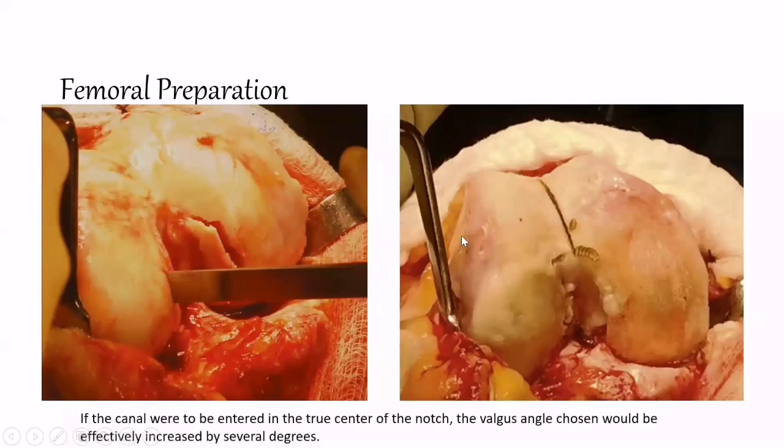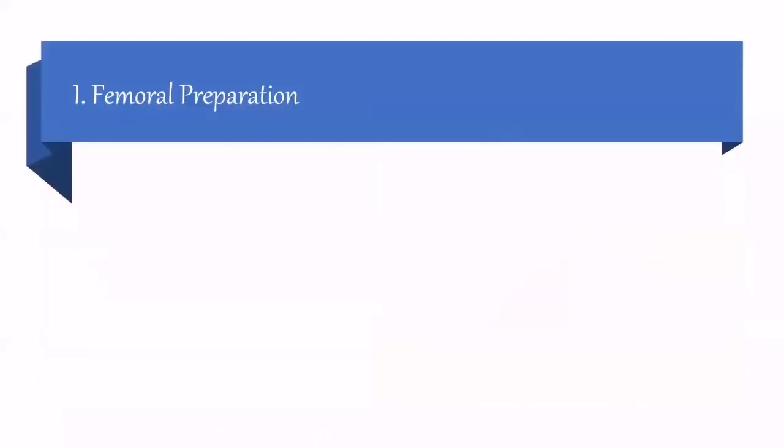Okay. So if the canal were to be entered in the true center of the notch, the valgus angle chosen is to be effectively increased by several degrees. And we knew how to measure the degrees of valgus cut.